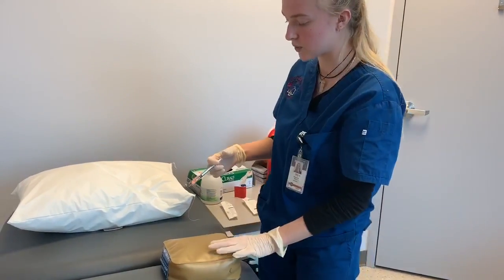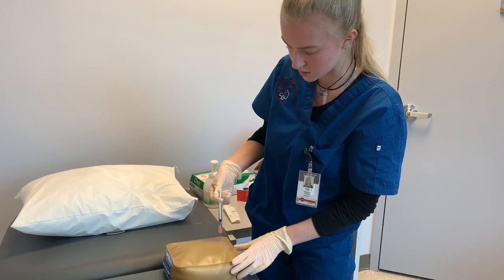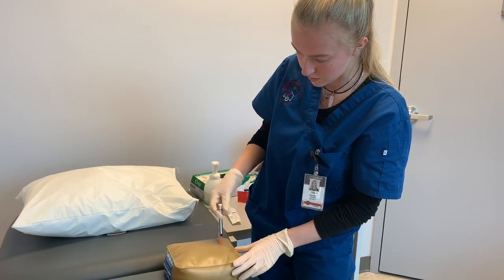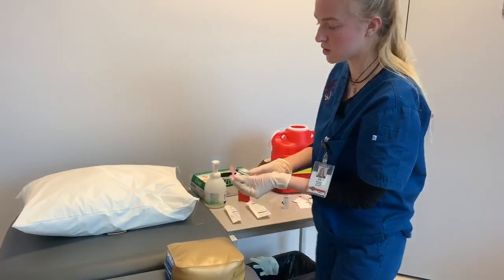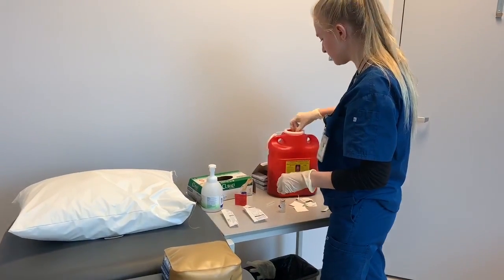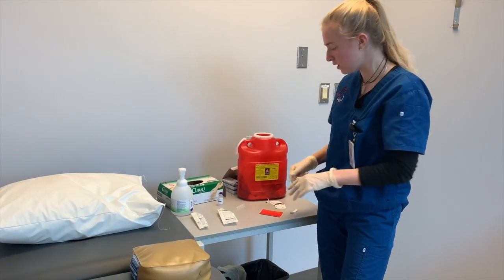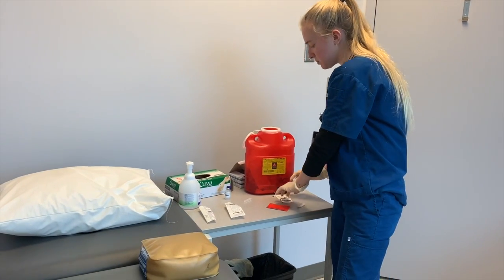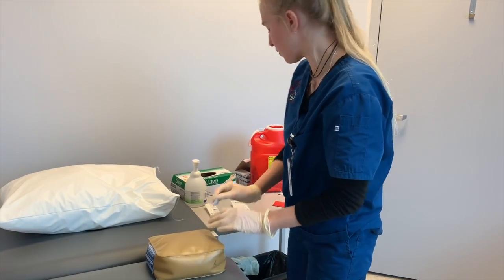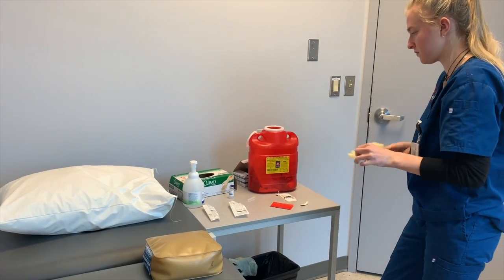The medication is just going to be administered at a 90-degree angle because it's intramuscular. I'm just going to insert it. I'm going to put the safety on the needle. I'm going to dispose of it in the correct container. So now that the needle has been disposed of, I'm just going to wipe off the patient. Okay. I'm going to dispose of my gloves.